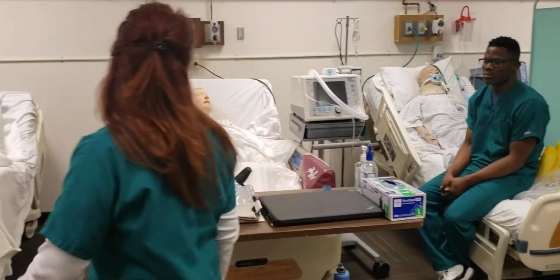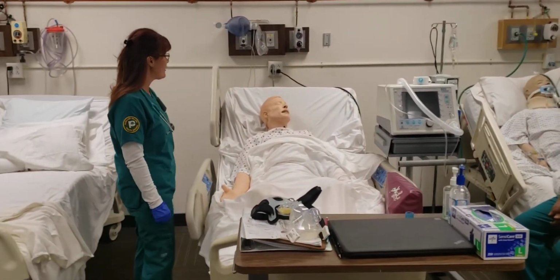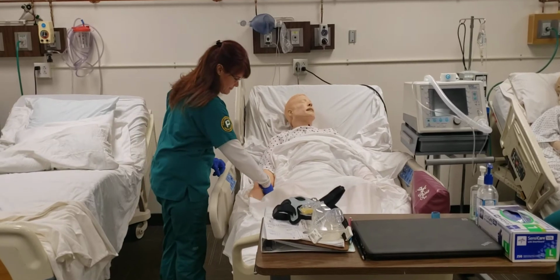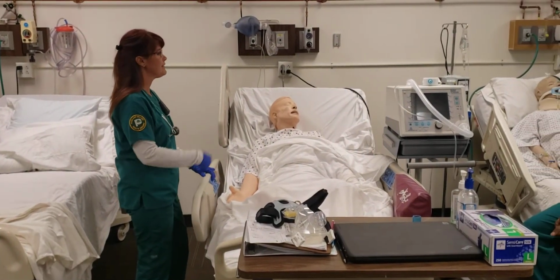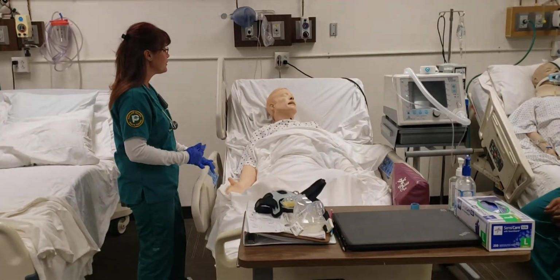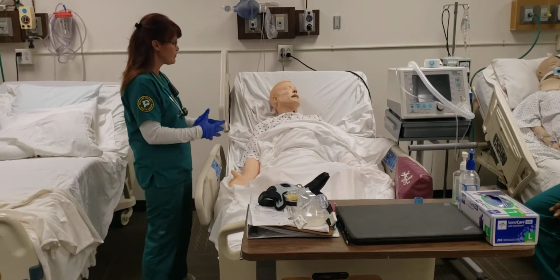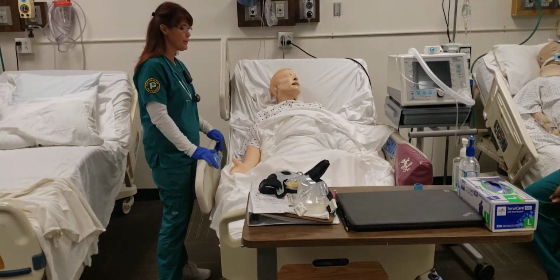Okay. Hello, my name is Amanda. I'm a respiratory therapist. Can you please verify your name and date of birth? All right, thank you, Mr. Wilson. Well, your doctor's ordered you to be put on the non-invasive ventilator. It's not a big deal. We're just going to put a mask over you, and it's going to help you breathe. It's going to give you some pressure to keep your lungs open, get oxygenation better for you.